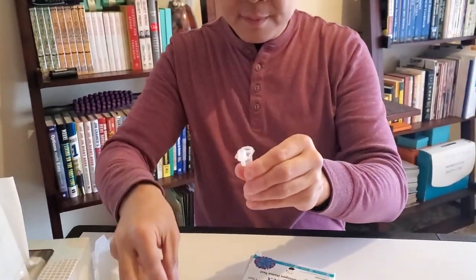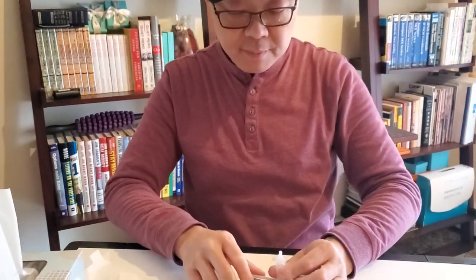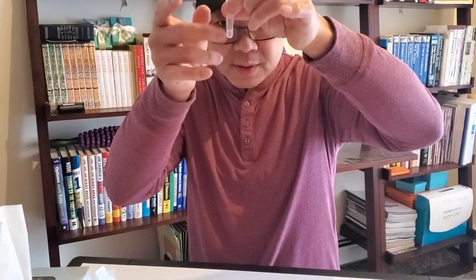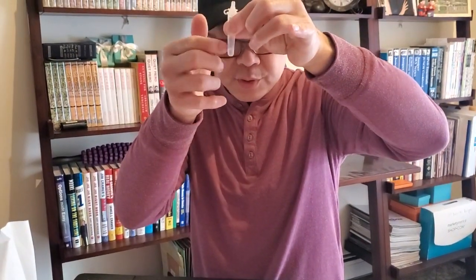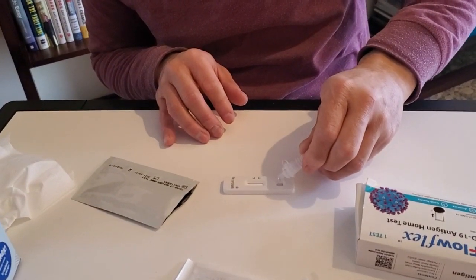You rip the tip off and close the cap. In the videos they show, there is a cap that they screw on. If you want, you flick it a little — you can't really shake it because it's such a small amount of solution, so you just flick it. Then you take the test kit out and put four drops into the well: one, two, three, four.